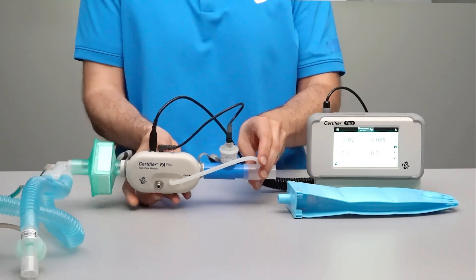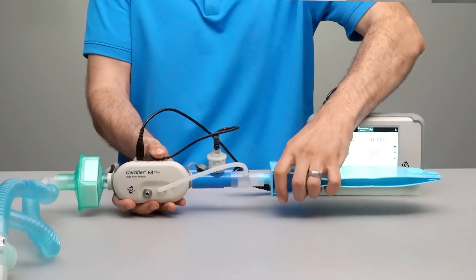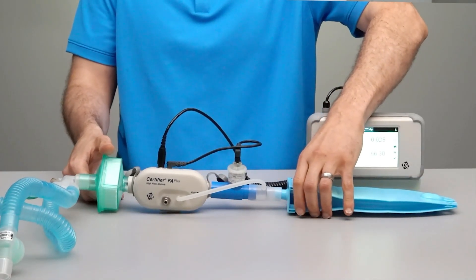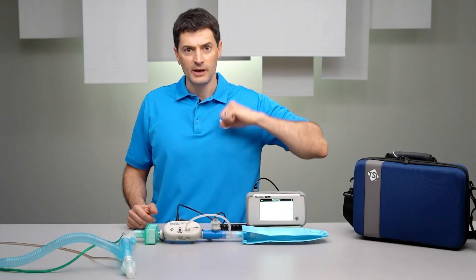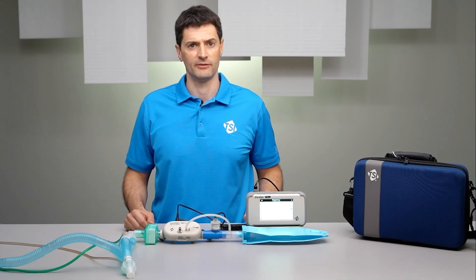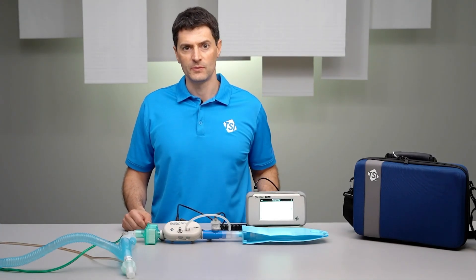To complete the test circuit, we will connect the test lung downstream of the flow module. The test lung simulates a patient's breathing and there are a variety of different types and sizes of test lungs that are used when testing ventilators. For our demonstration, we're using a one-liter test lung.